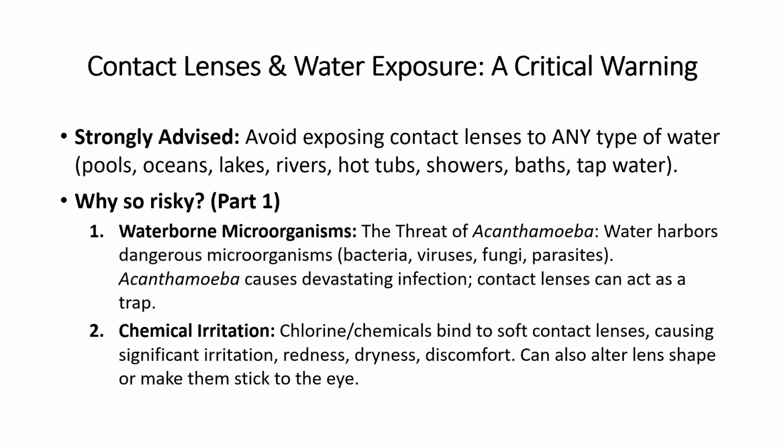Now, let's revisit and reinforce a critical warning: contact lenses and water exposure. It is strongly advised by eye care professionals, the FDA, and the CDC to completely avoid exposing contact lenses to any type of water. This includes swimming pools, oceans, lakes, rivers, hot tubs, showers, baths, and even tap water for rinsing or storing lenses. The consequences of ignoring this rule can be severe and vision-threatening.